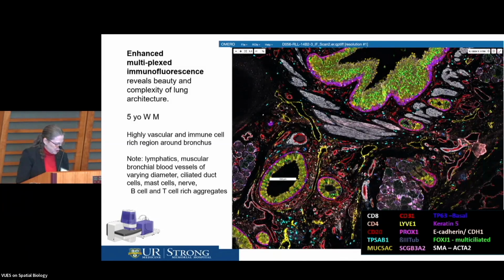It's a view of the cells immediately below the tube that we just slid down, using just 15 antibodies. At the top, in the yellow-green, you're seeing the epithelial lining cells with cilia and mucus production. And in the purple, basal cells that are available as precursors to repopulate the epithelium. Those green, yellow, purple cells all look pretty uniform here in this 2D with only 15 antibodies. But I'll show you that they are not when we tease apart the many cell types that are present.